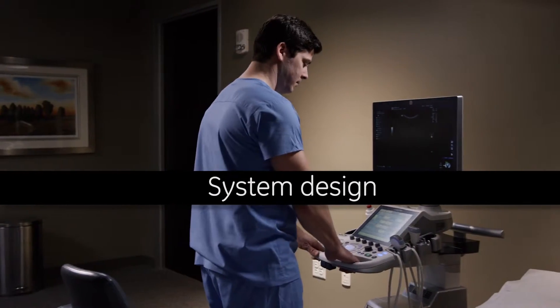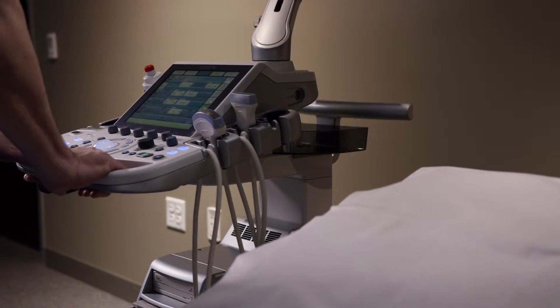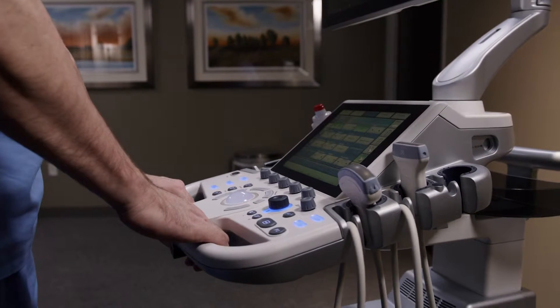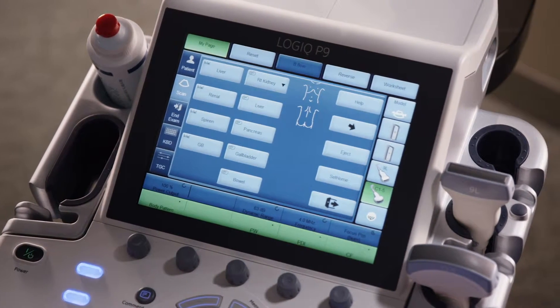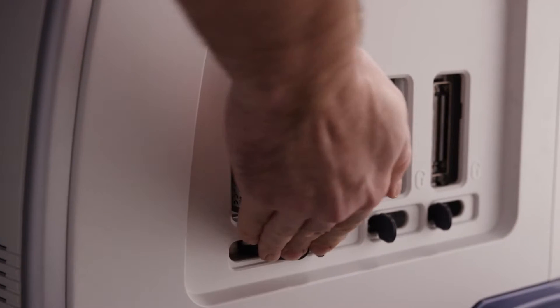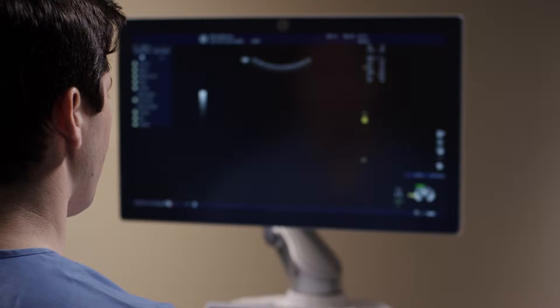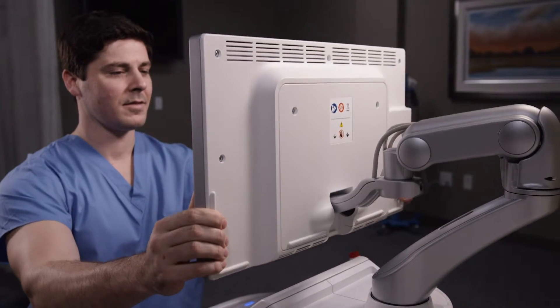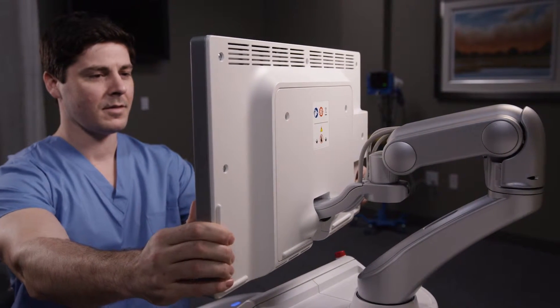The small body maneuvers easily and fits into small spaces. The console smoothly moves up, down, and swivels. The system has four probe holders and four active probe ports. Probes easily slide and lock into the ports. The large monitor offers a clear view for the operator and the patient, and its articulating arm has a broad range of movement.